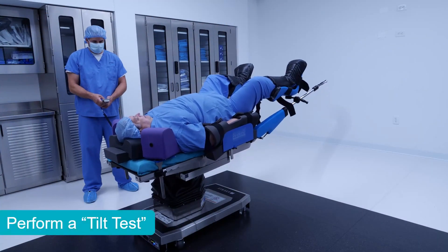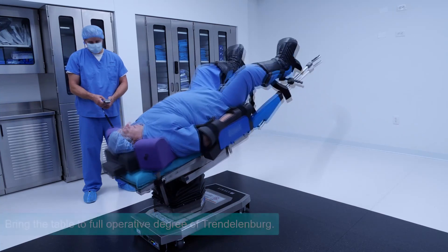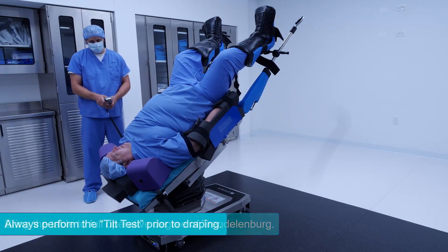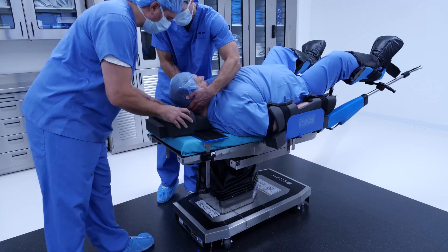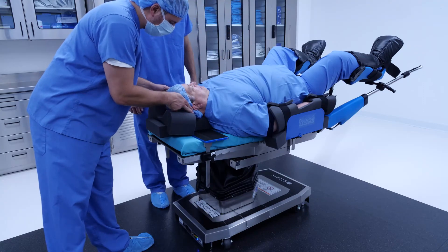The final step in installing TrendGuard is the tilt test. Bring the patient into the full operative degree of Trendelenburg and hold for a five count. As you can see, with a little practice, positioning the patient with TrendGuard takes less than two minutes. Repositioning the patient or sliding them down the table after intubation is simple and easy as well.